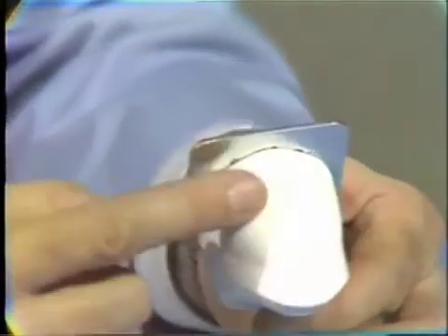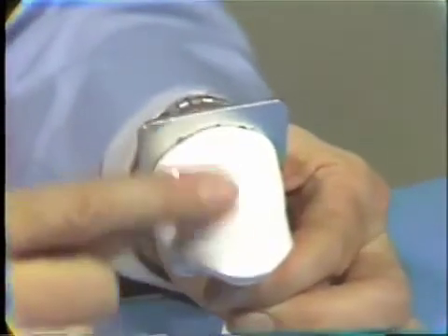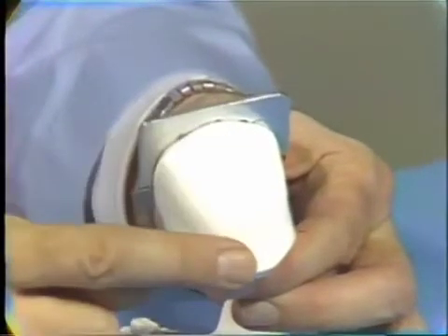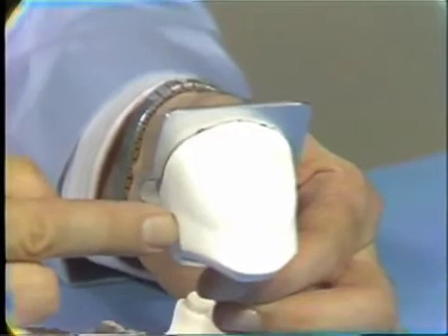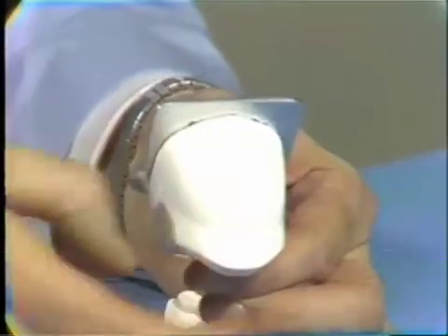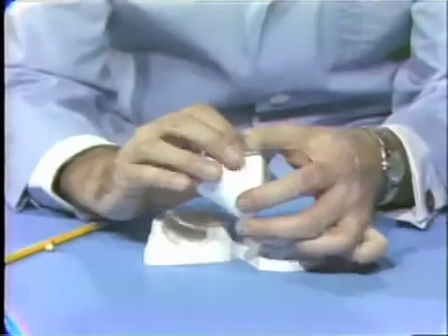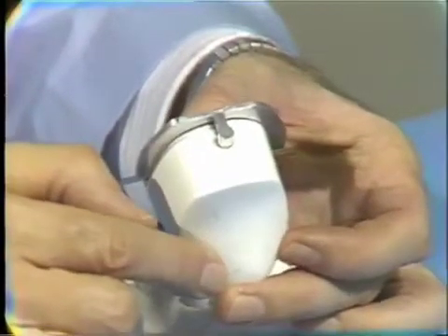First of all, we've got to adapt it for the correct vertical height. Usually the Trupontic, as it comes from the supply house, is longer than is necessary. Then we have to modify the proximal surfaces to taper the mesial and distal proximals in order to open the proximal embrasures, and then adjust the lingual surface to develop the correct ridge lap adaptation to the soft tissue.